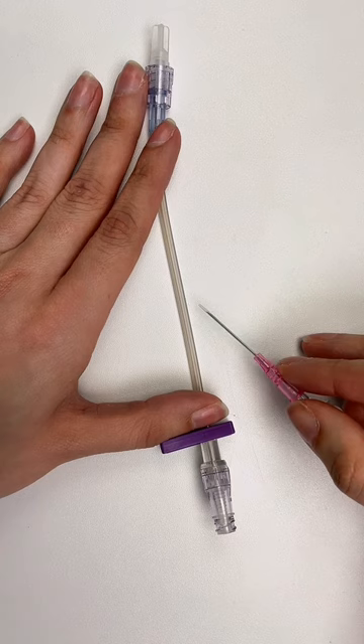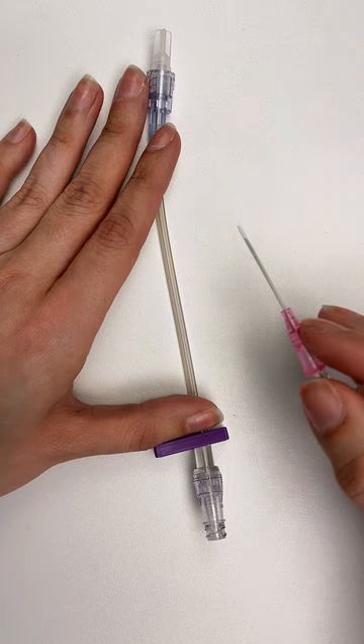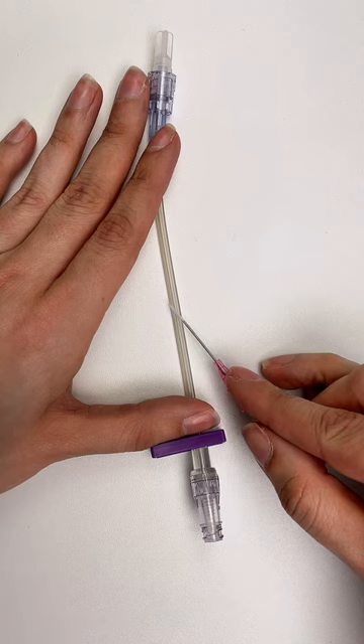So you need to make sure that we are not taking up a lot of space with this needle in the skin. Otherwise, we're going to end up with just a little bit inside our vein, and that can lead to infiltration, complete dislodgement with your patient moving their arm, and other complications along those lines.